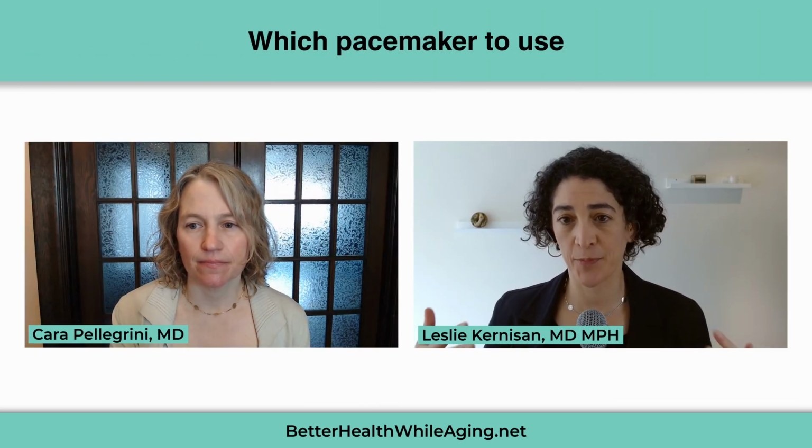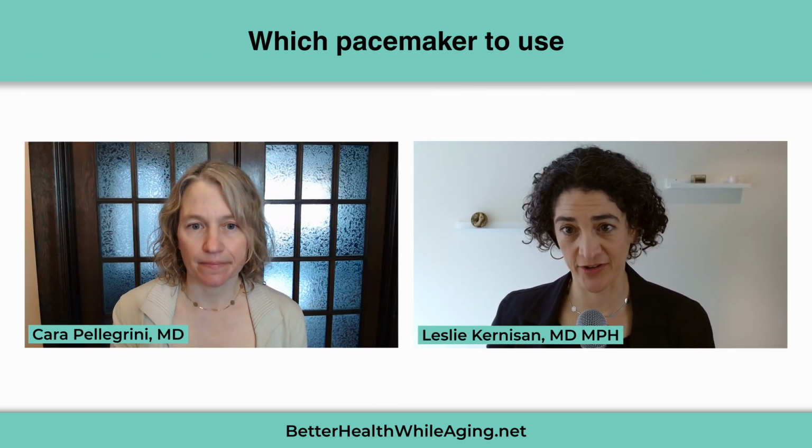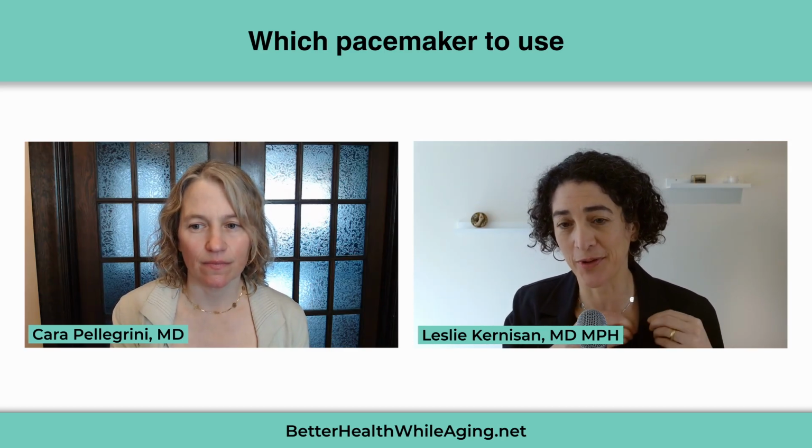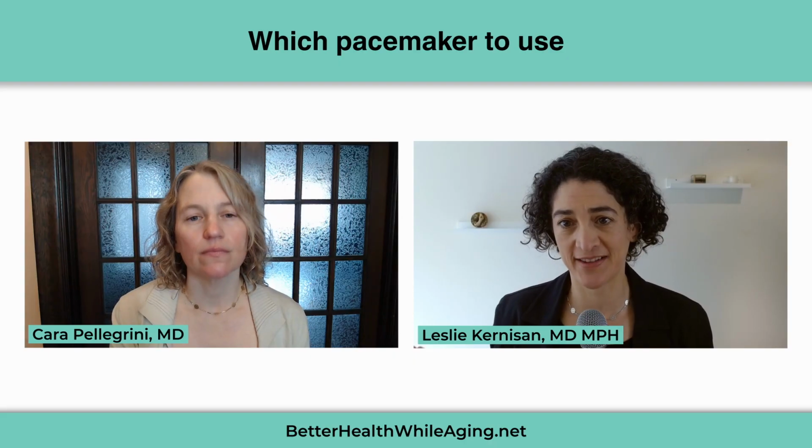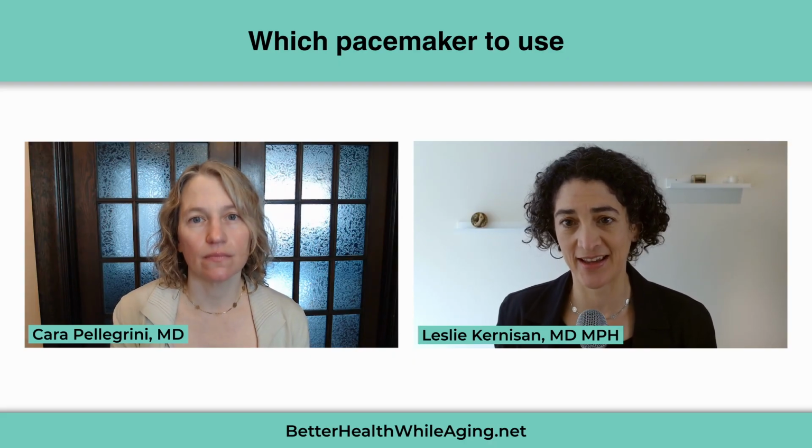So it sounds like if what a person has is sinus node dysfunction, kind of garden variety, the heart's gotten older, the electrical signal in the sinus node is either not coming as often as it should or having trouble spreading efficiently, then a pacemaker, especially if the person has been having symptoms, can be put in there, and will make sure the heart beats at least as often as it needs to.